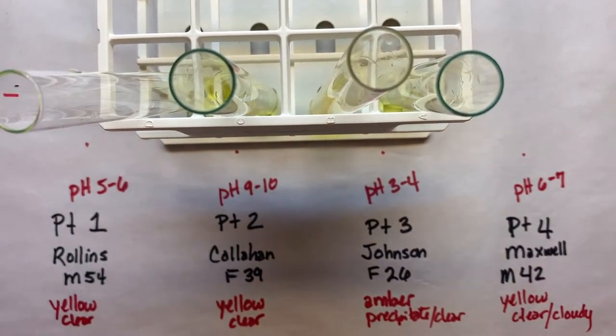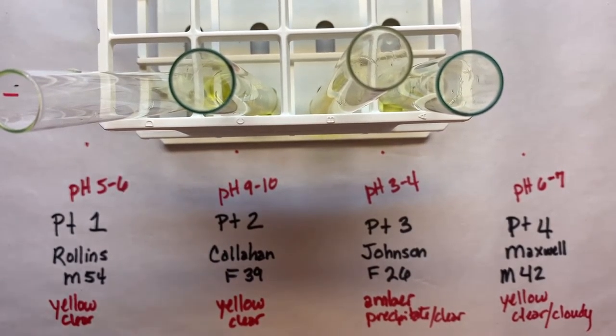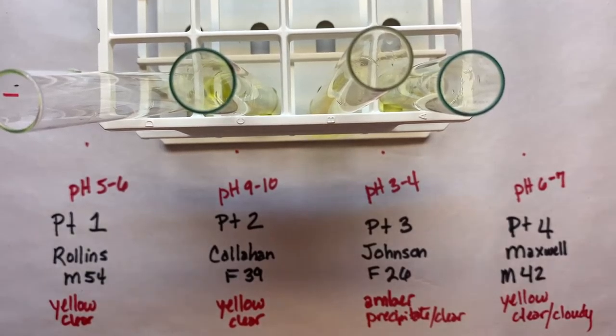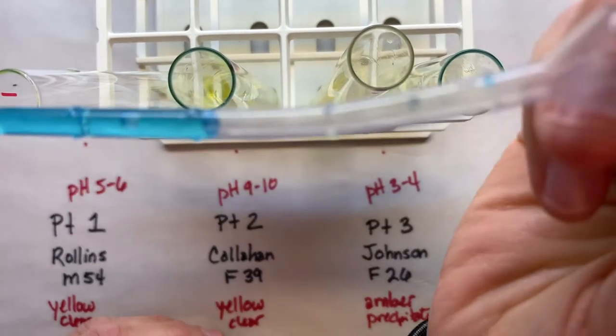And now we're going to do 10 drops of Benedict's solution, and then we're going to go over to our heat source where we've got our hot water. We're going to let this sit in it for two to three minutes. So here, let's count 10 drops.